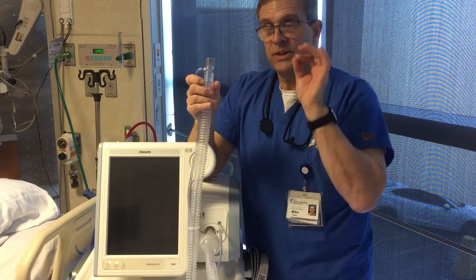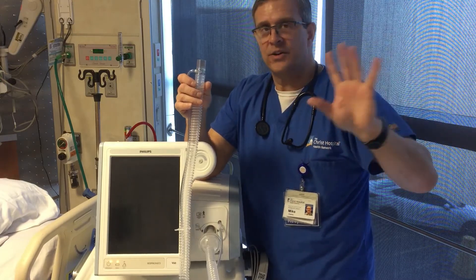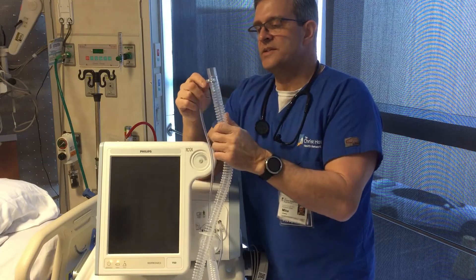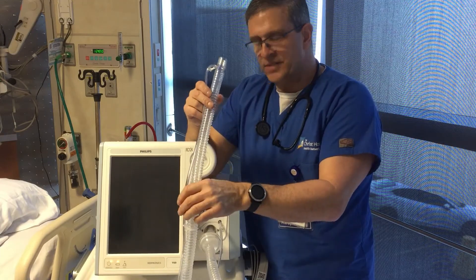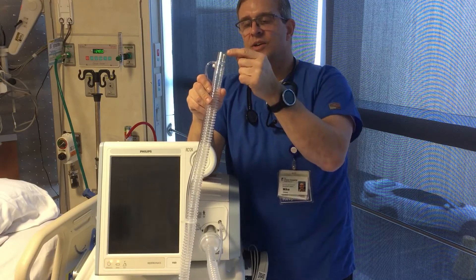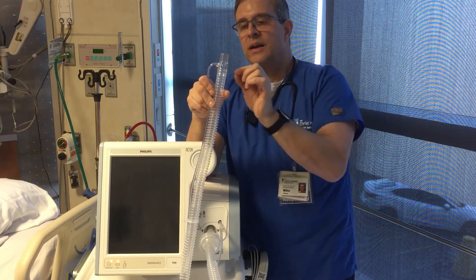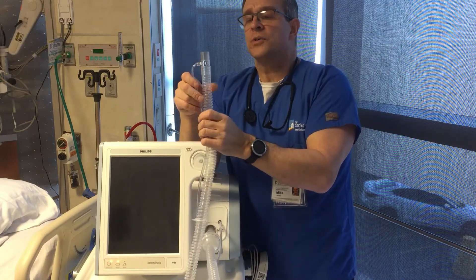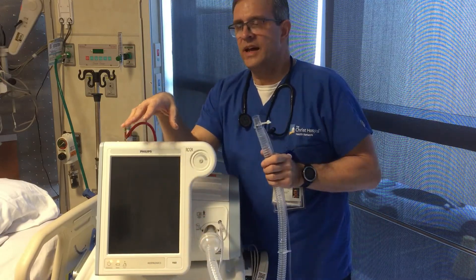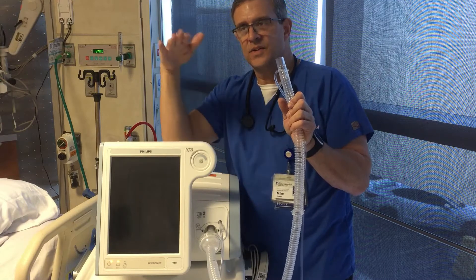On non-invasive ventilation, because there's no internal exhalation valve and no two-limb circuit, we have a port here — and the point is you always need an exhalation port. When the system is pressurized and the patient exhales, you want a place for the gas to vent out so their CO2 goes out the port and they don't rebreathe it. It also allows extra pressure to vent. This is a pressure-regulated system, so you need a place for gas to leak out to maintain the pressures.